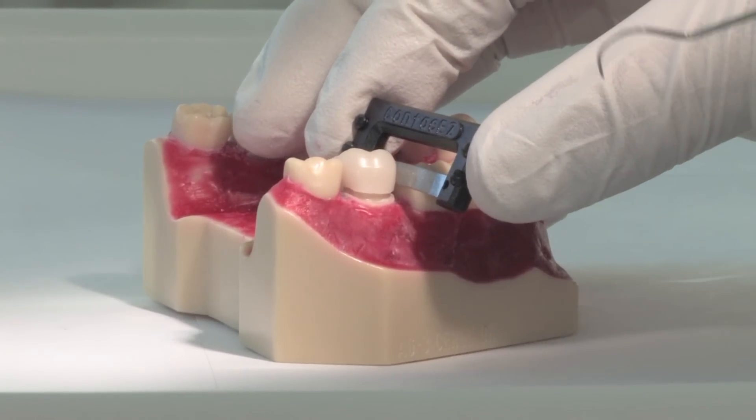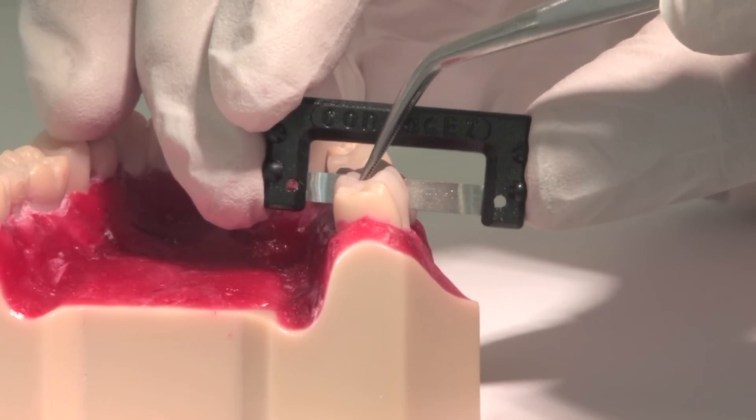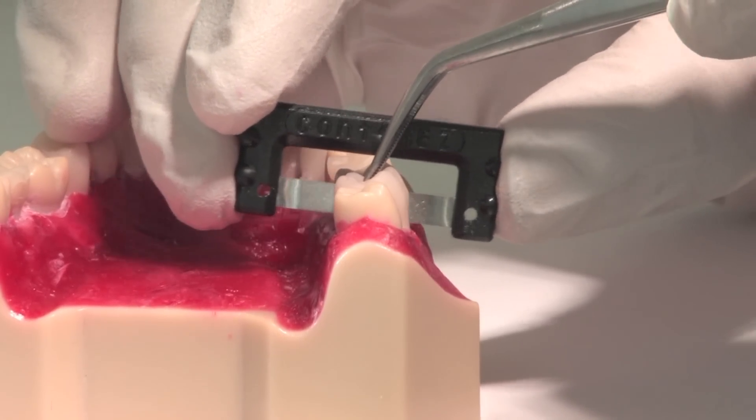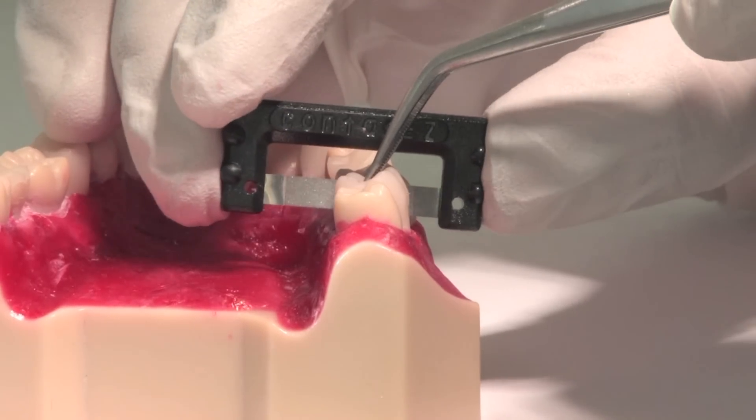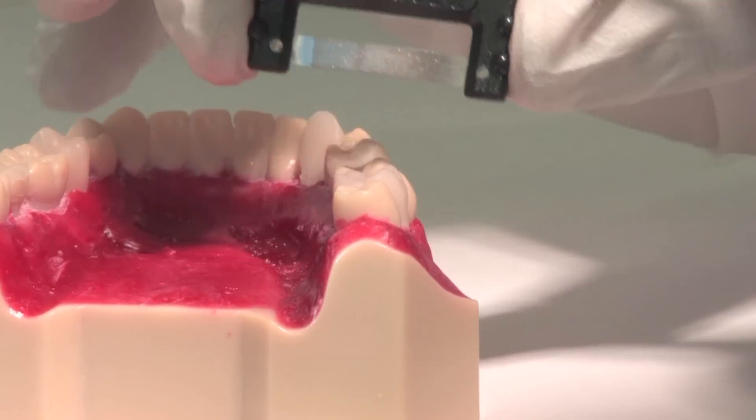Insert the strip into the mesial side while you hold the crown with an explorer. Pass the strip buccolingually two or three times. If you press down on the crown, the strip may become pinched. If so, begin moving the strip with the grain of the diamond powder to get it started.